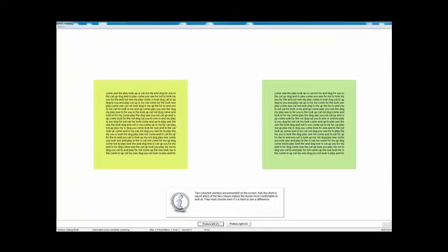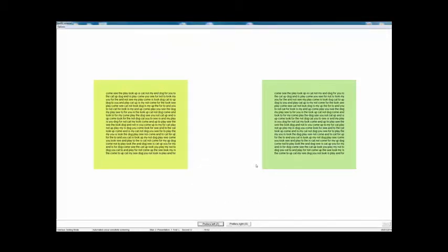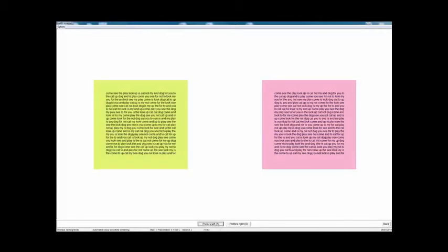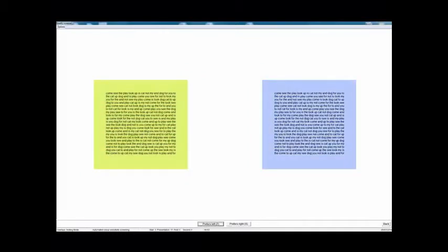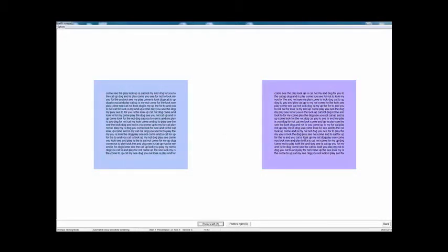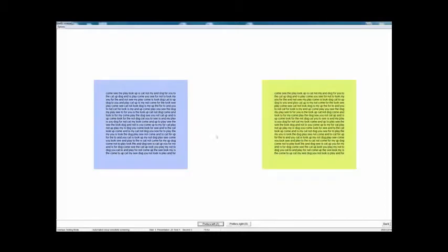I've now clicked on auto test, and the computer does the complete routine for you. The task for the patient is simply to say which of these two colors is more comfortable to look at — which one minimizes the symptoms that they've reported — and you force them to choose. Let's say the one on the right is slightly better than the left. The blue looks good, so I'm going to click on that. The computer program will automatically go all the way through all the different colors, comparing every color with every other color and doing quite a lot of cross-checking along the way.